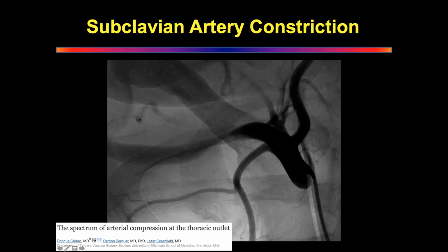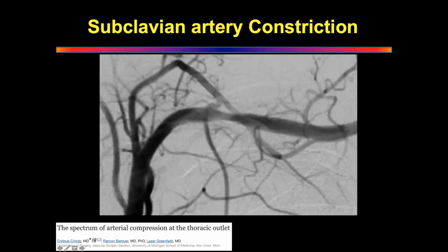What area is likely to be affected here? Axillary artery. No, what area? Which triangle is likely to be affected? So the costoclavicular. This looks like it's in the costoclavicular. So when you discuss an angiography, you must say it looks likely in a costoclavicular area. Yeah, you must use this word so that the examiner knows that you're talking sense. Okay. Again, this is difficult to interpret because it's overexposed. So you can't see the ribs very well, but you can see the vessels much better.